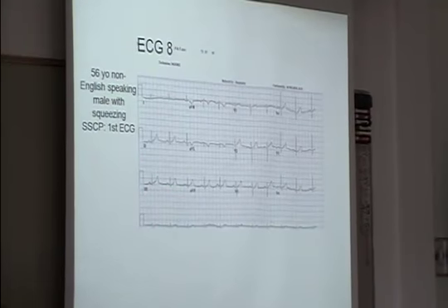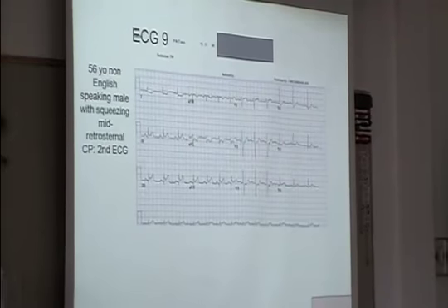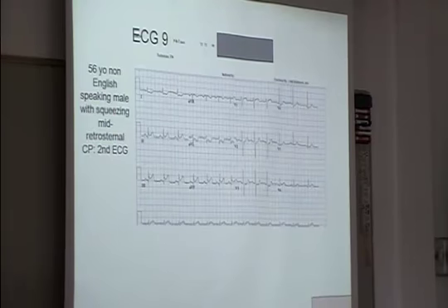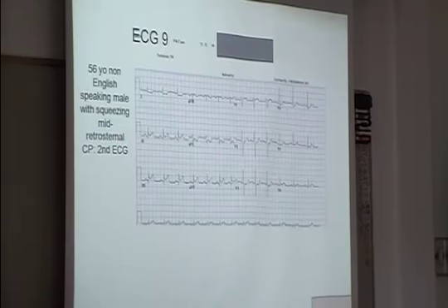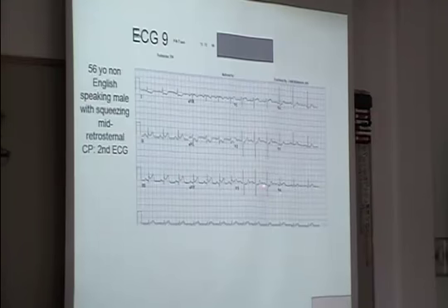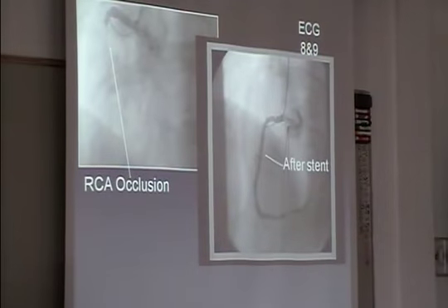On the stress test, we have to see three consecutive complexes with ST depression before we consider it significant. As his chest pain got worse, the second EKG — this shows you the value of that repeat EKG. Now he's clearly evolving an inferior ST elevation infarct with high lateral ST depression in lead 1 and aVL, and a little bit of ST depression — but this is the striking thing here. How long between those two — 12 minutes?